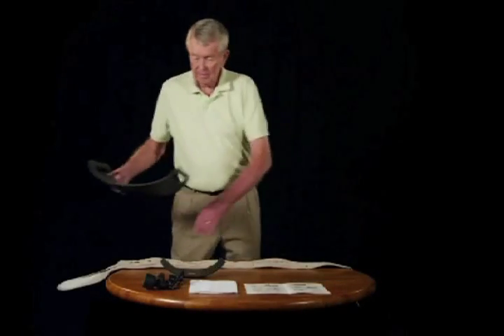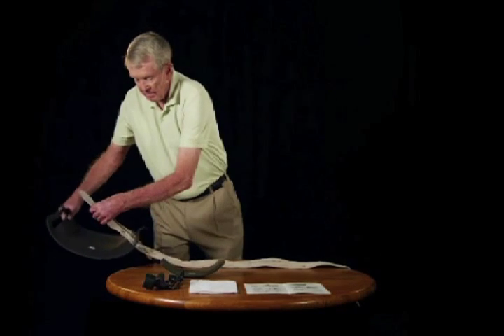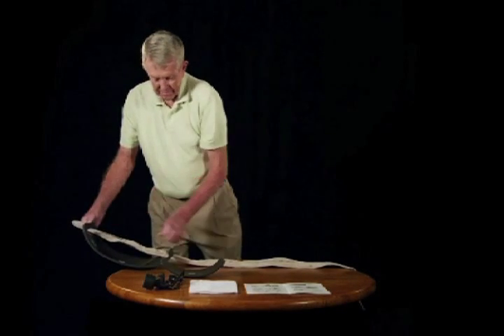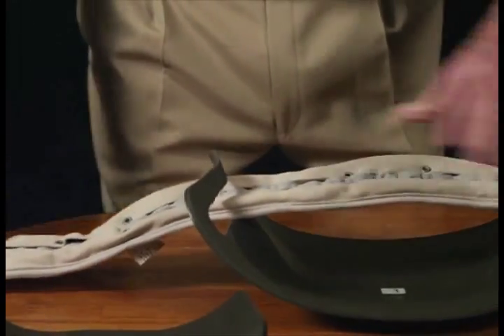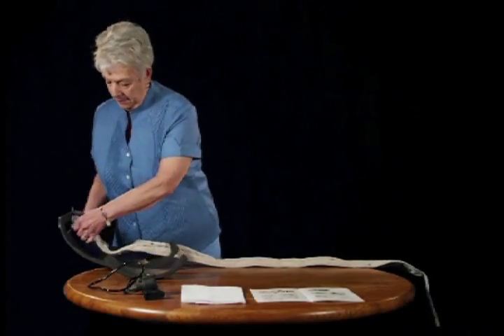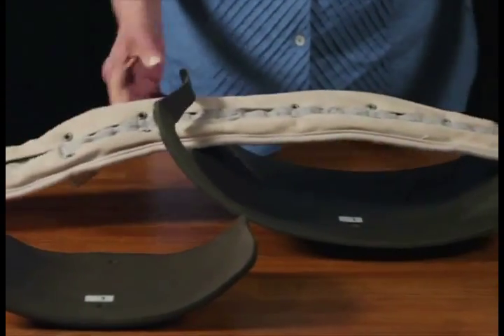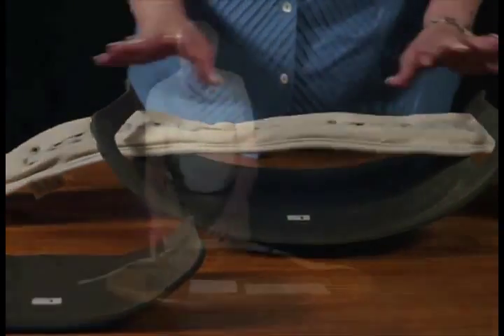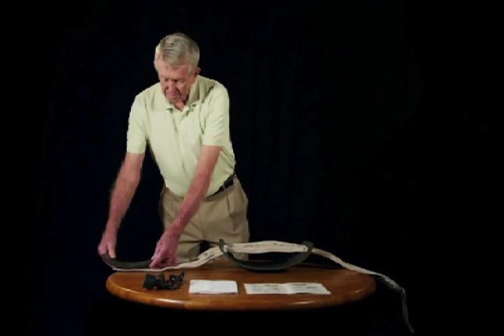To add the back panel, simply thread the DDS Belt through the inside of the back panel. Next, add the front panel by attaching the front panel to the supplemental Velcro strap.